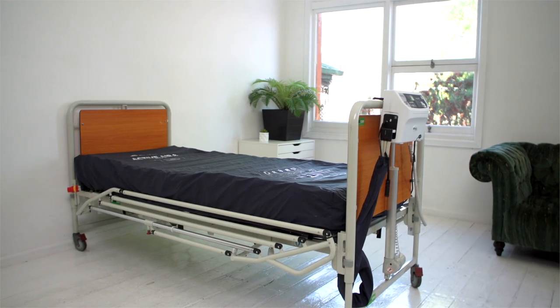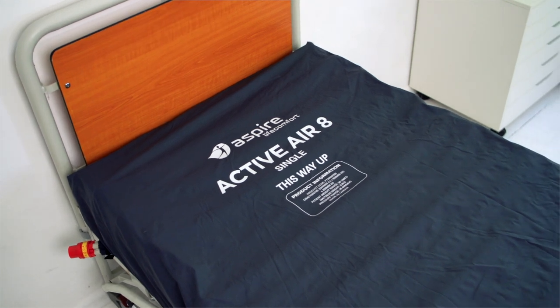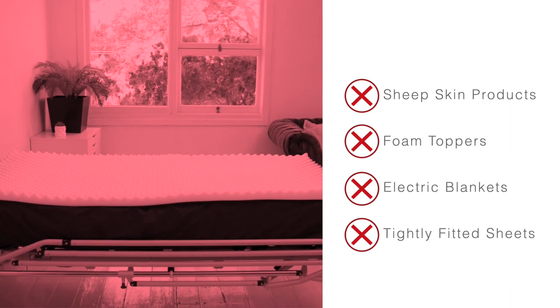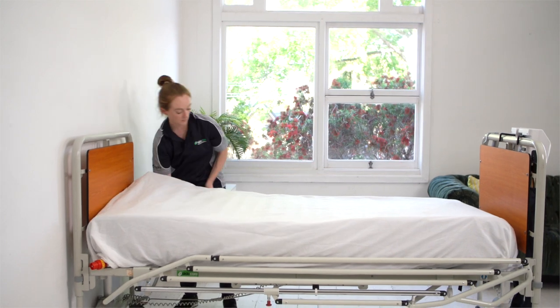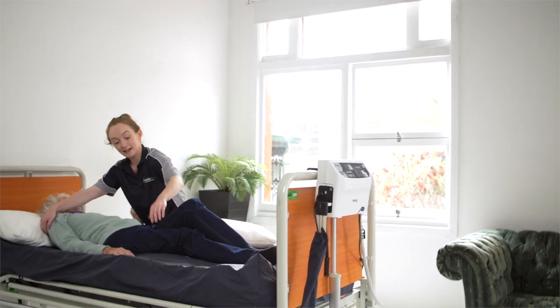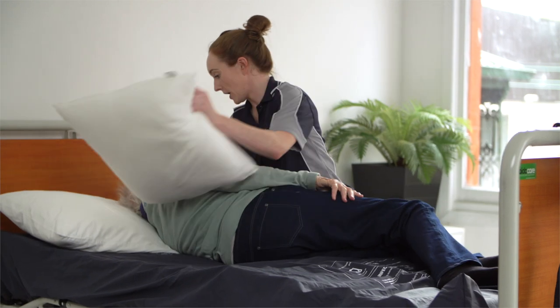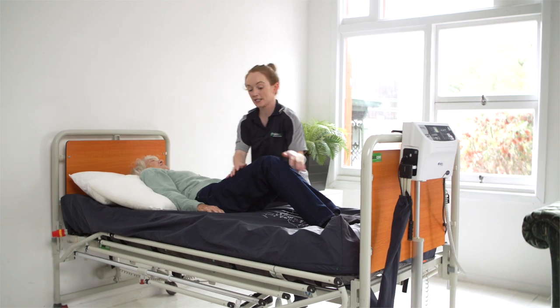For an alternating air mattress to work effectively, you should carefully consider what goes on or over the mattress. Never place sheepskin products, foam toppers, electric blankets, or tightly fitted sheets on an alternating air mattress. A loosely tucked sheet is appropriate and still allows the mattress to work effectively. Even with an alternating air mattress in place, it is still important to regularly reposition the user to ensure maximum protection — do this in accordance with the individual's risk assessment.